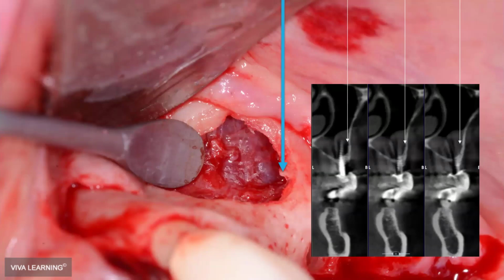And you can see a pretty large arteriole there that's actually attached to the Schneiderian membrane. So it's either like this, where it's attached to the membrane, but they had a little channel in the bone. It might be completely interosseous, a canal that's completely inside the bone, or it could be completely inside the Schneiderian membrane.